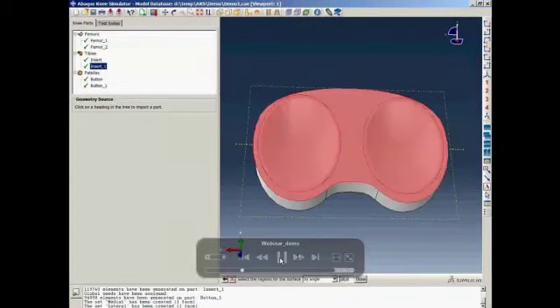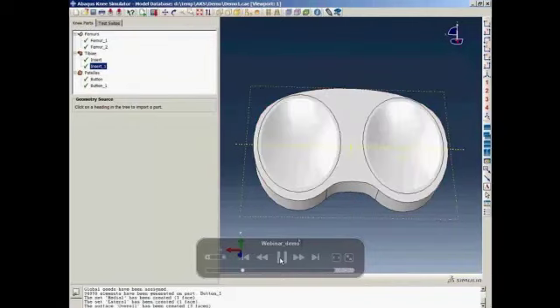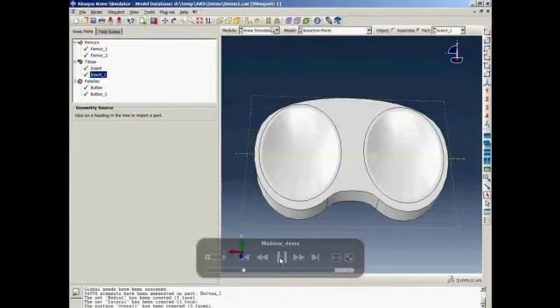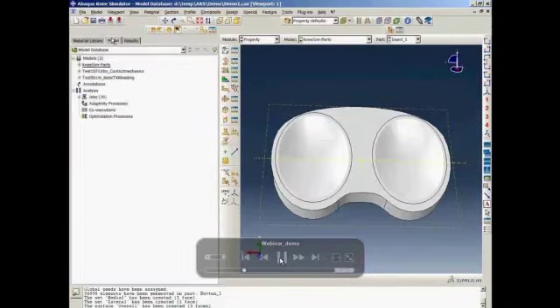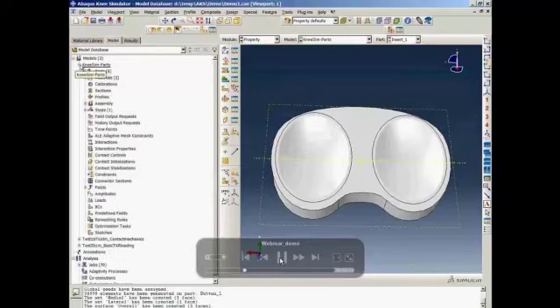Here we use the tools available in Abaqus CAE to pick surfaces by angle. And now we switch to the analyst view just to show how the other functionalities in Abaqus CAE can be used in combination with Abaqus Knee Simulator. So once the knee parts have been imported into Abaqus Knee Simulator, they will all appear under the knee sim-parts model. So this is, like I mentioned, back in the analyst view.